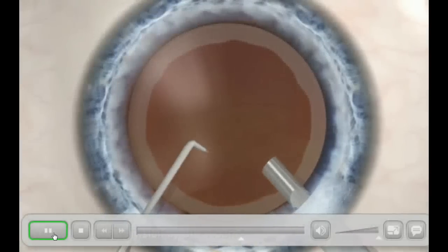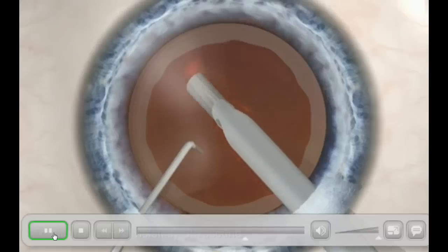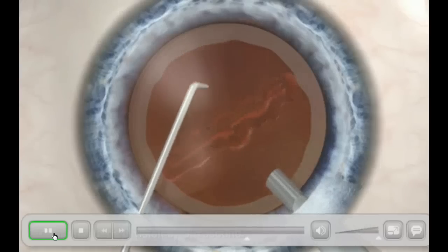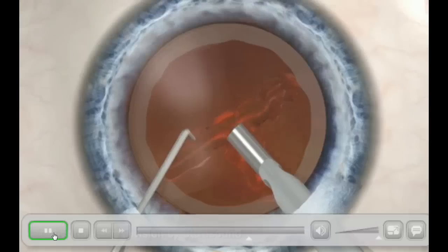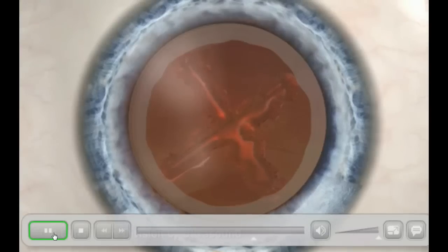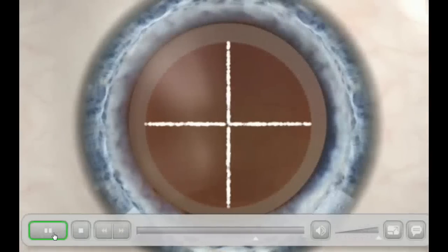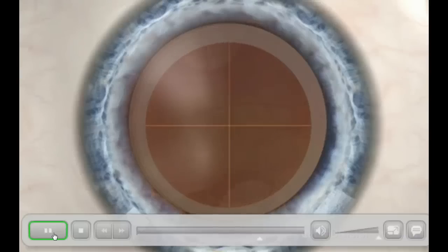Once the outer capsular tissue is opened, the lens must be split into manageable size pieces for removal. Traditional phaco emulsification uses ultrasonic energy to divide the natural lens into quadrants. This step is now performed in an instant and with much less energy with the femtosecond laser.